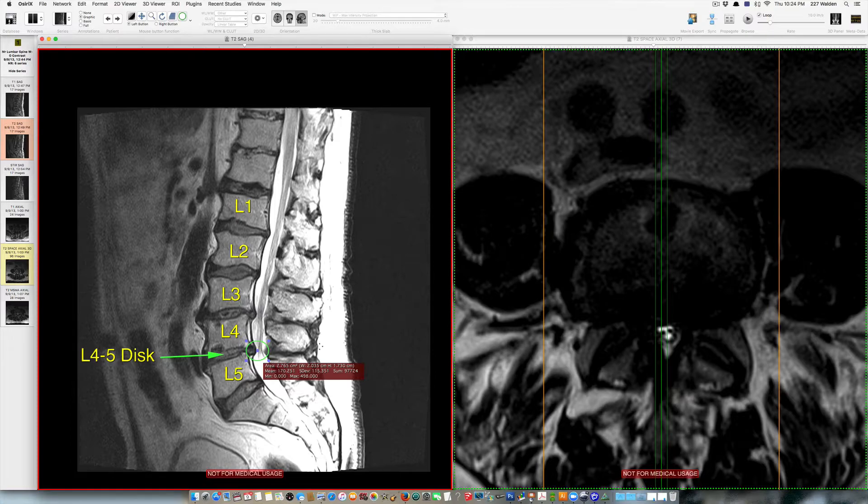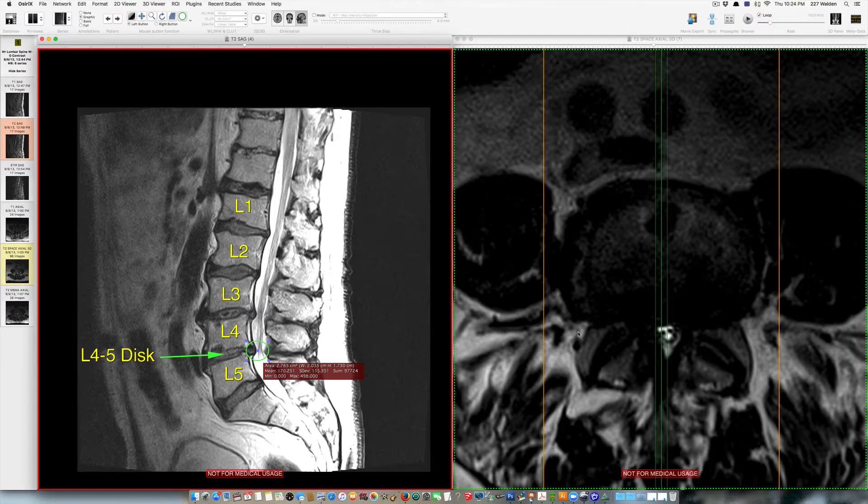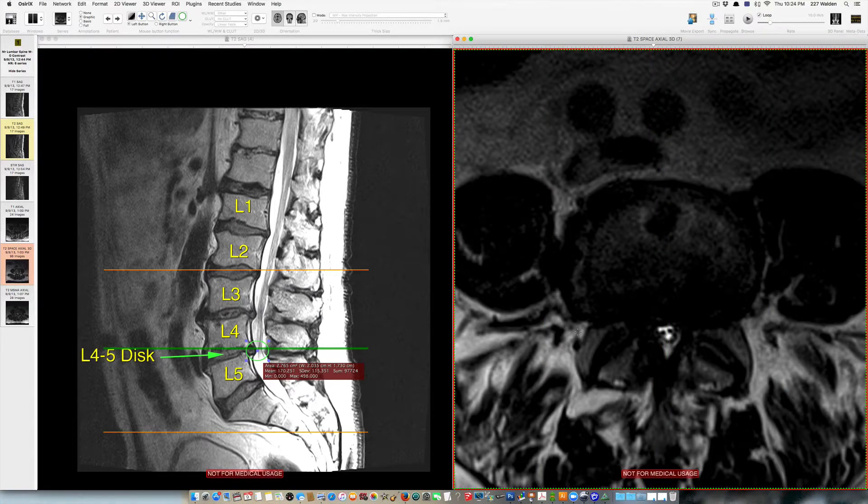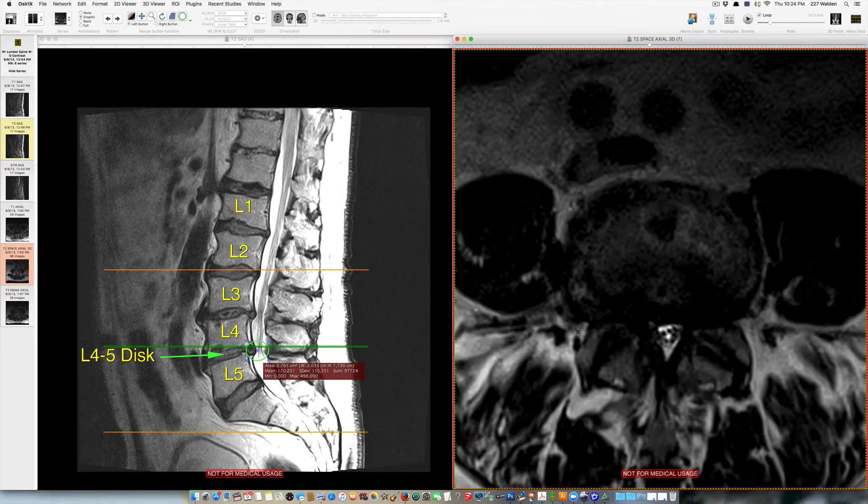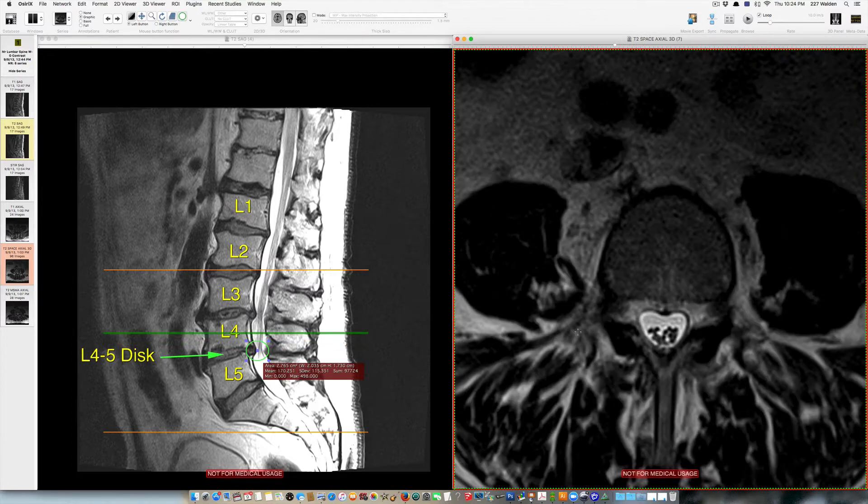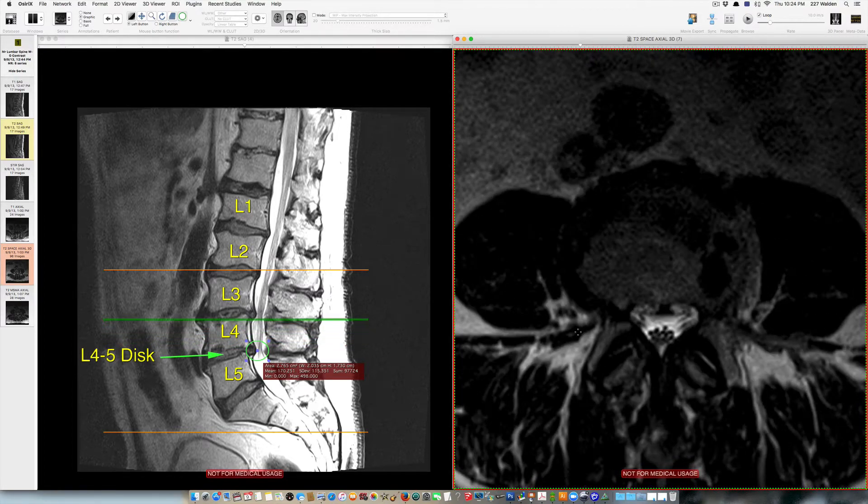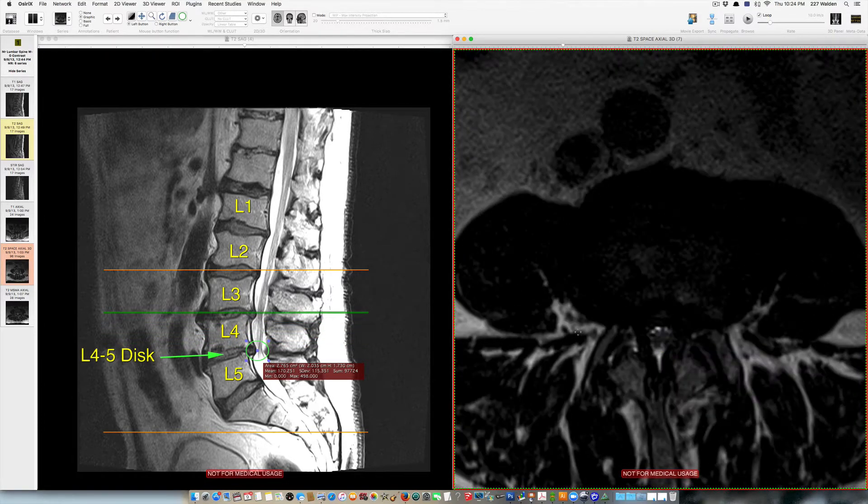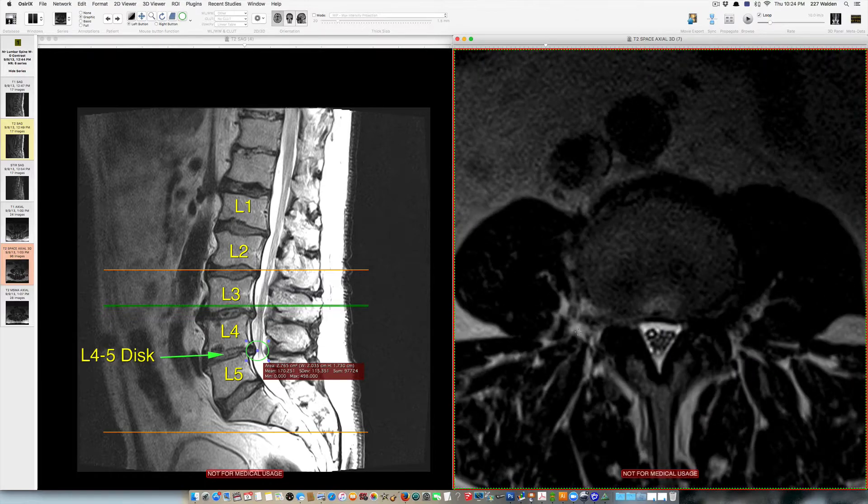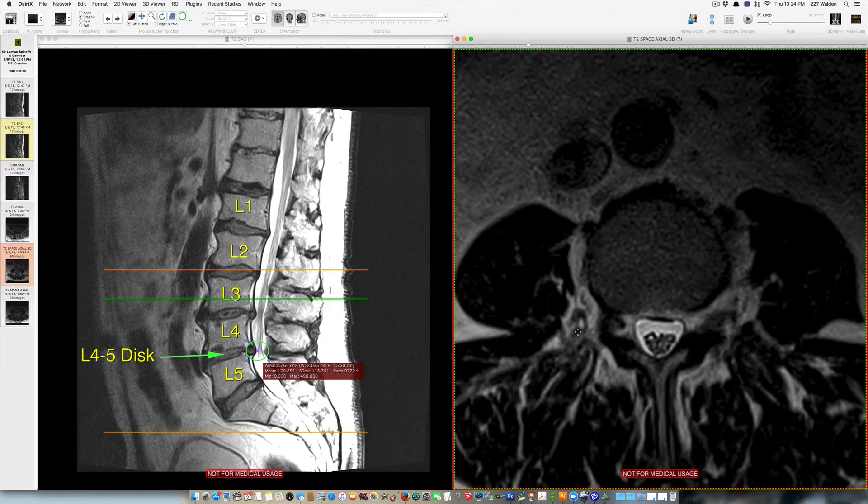This image over here is what we call the axial image and if I click on this image I scroll up and down the spine. So we're going to go up to a normal level behind the L3 vertebral body where there isn't much in the way of stenosis.